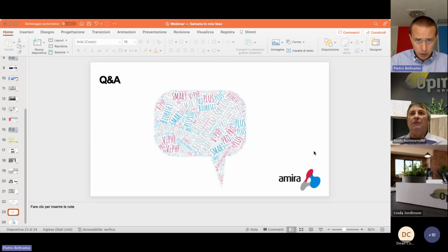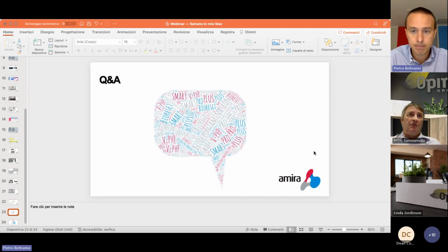There are no water droplets, not with a VHP. With a gas, forget the water droplets. It happens only with the aerosol. And in case of aerosol, then you have water droplets everywhere, and then you have to wait for those to dry out.